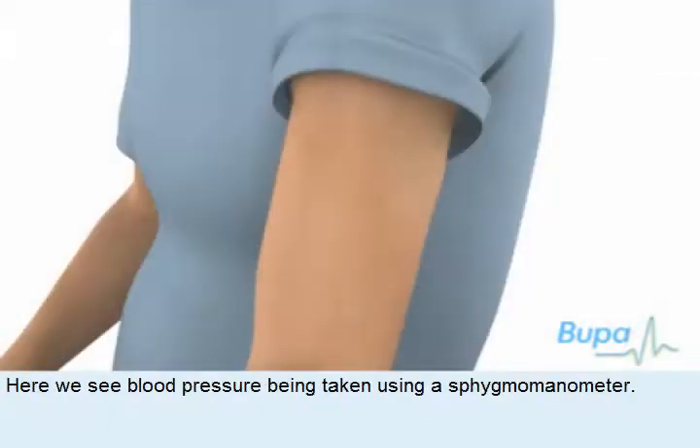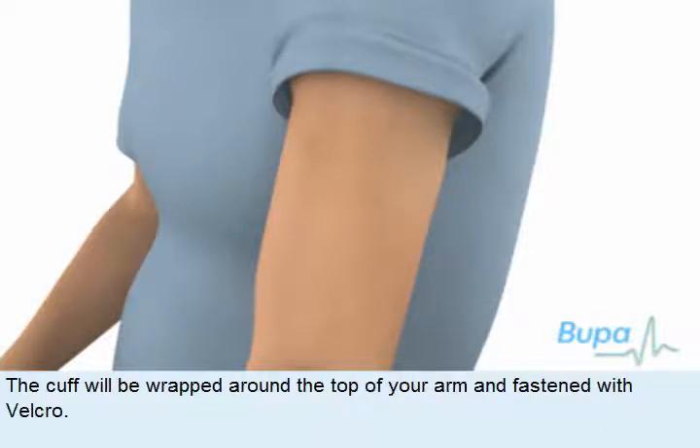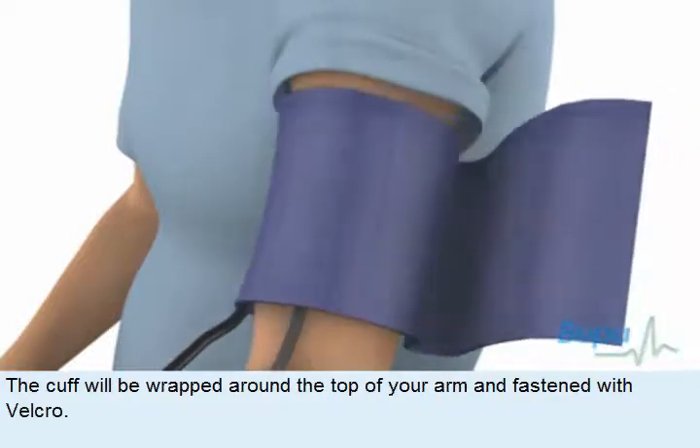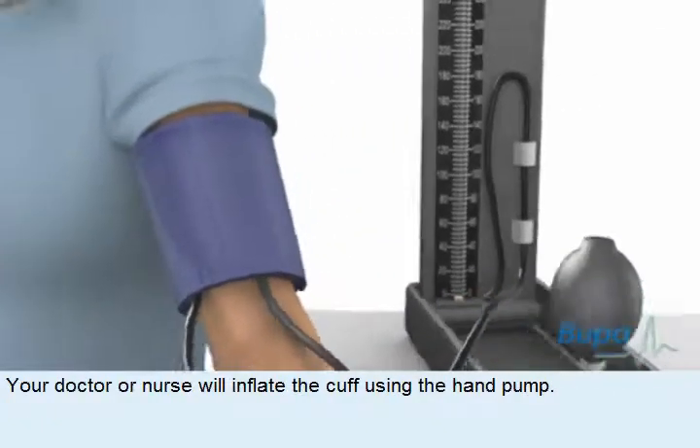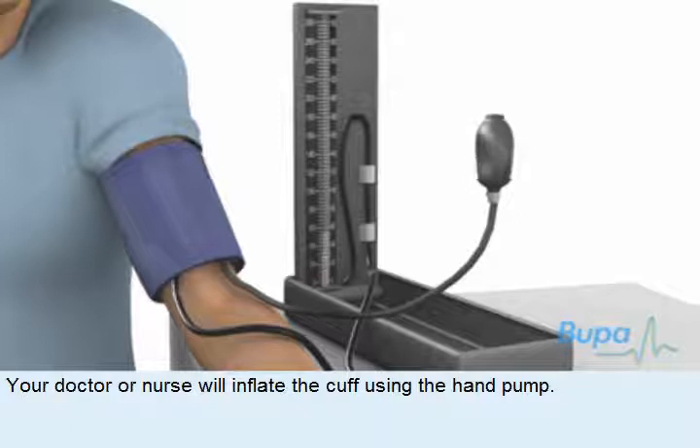Here we see blood pressure being taken using a sphygmomanometer. The cuff will be wrapped around the top of your arm and fastened with Velcro. Your doctor or nurse will inflate the cuff using the hand pump.